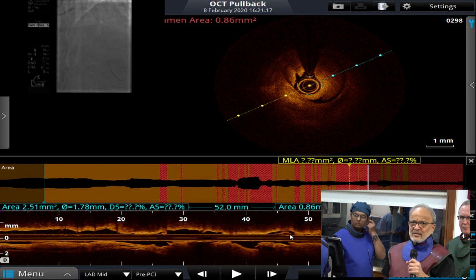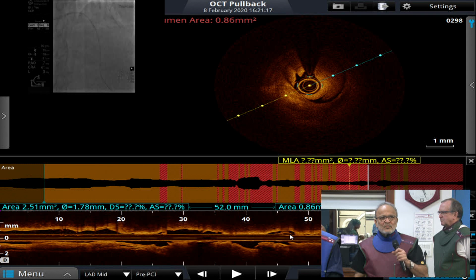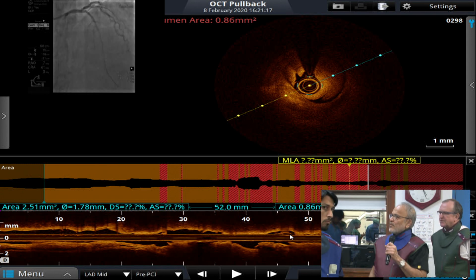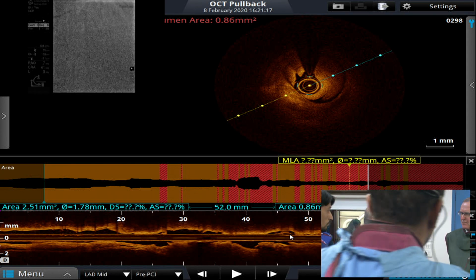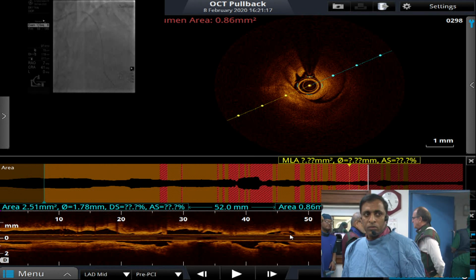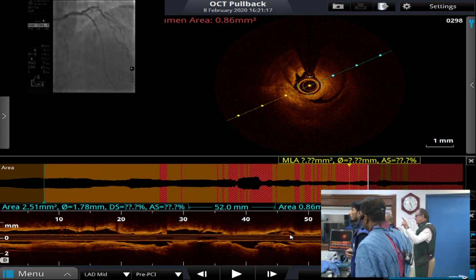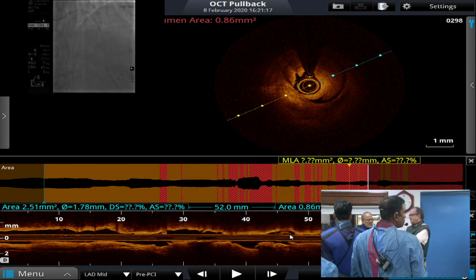Let's get the longest 2.5 NC you've got and dilate that some more, because that was pretty hard to get the OCT. You want to take a 2.5 stent? No, I want a 2.5 NC balloon. 2.5 by 20 NC Emerge or NC Trek. We're also going to measure for our stent length, and we can even compare that to your OCT measurement if you'd like. This OCT catheter is a very, very delicate catheter.